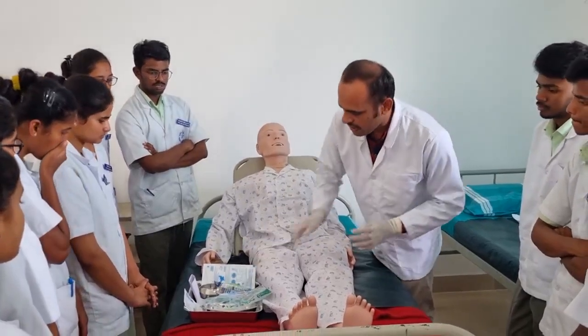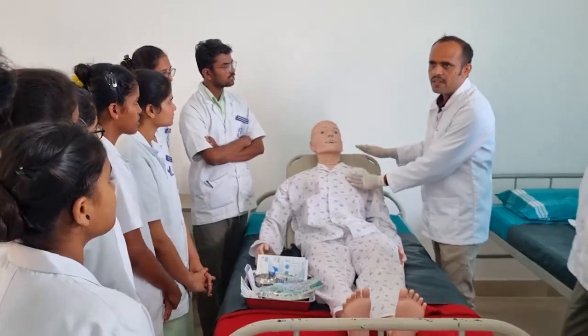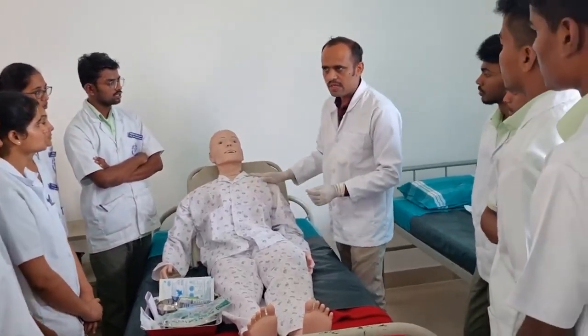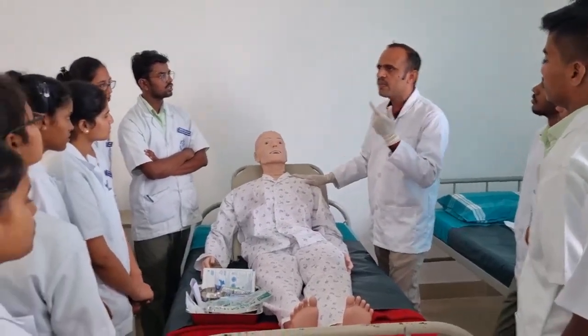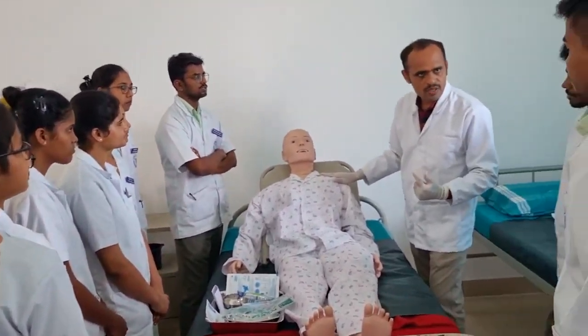Before starting the procedure, we have to place the patient in high Fowler's position. That is high Fowler's position. It will aid the entering of the NG tube from the nostril up to the stomach.